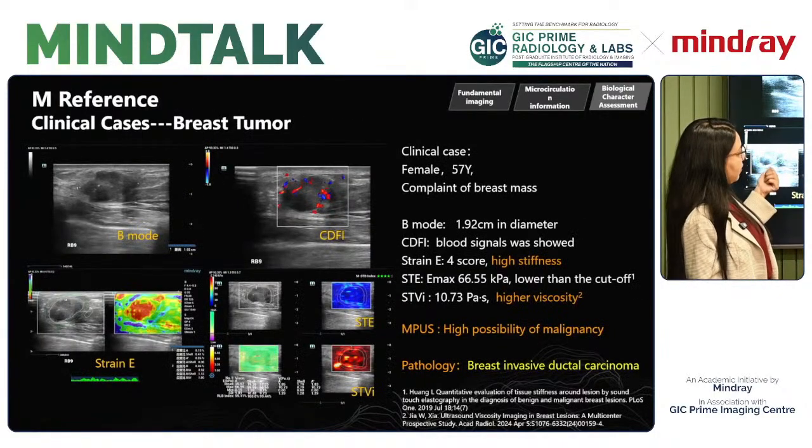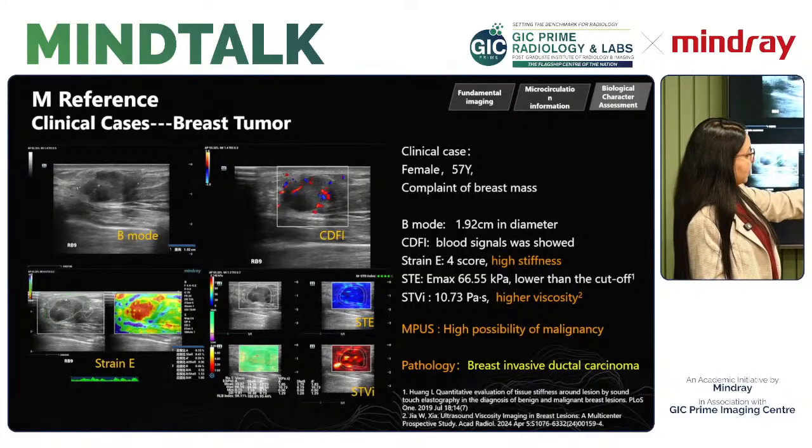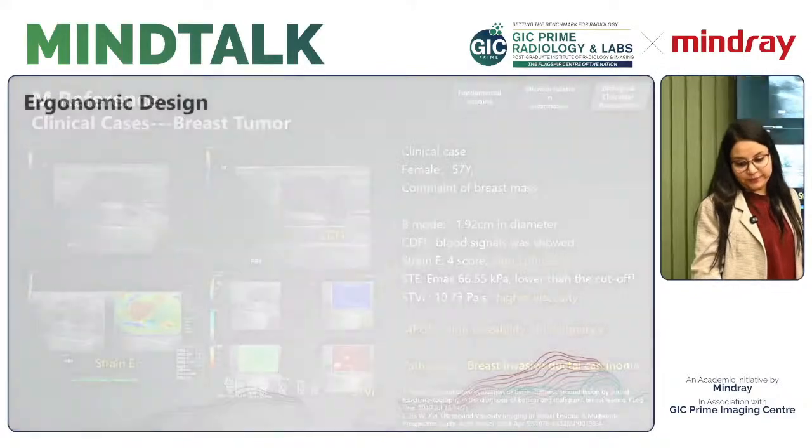So that becomes very easy with our M reference. The technology is called M reference. So even in breast imaging, breast tumor also, you are able to get the STE, the viscosity, the fat quantification, all these things in one touch.